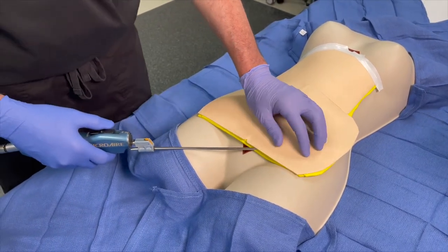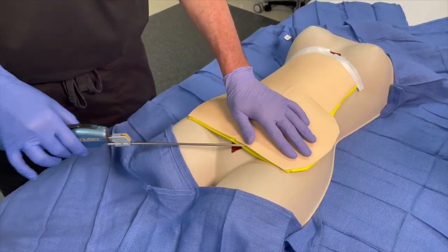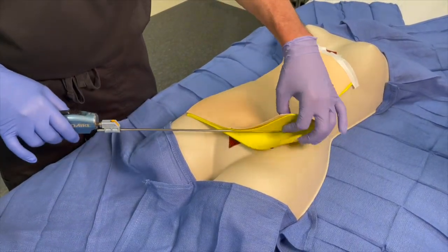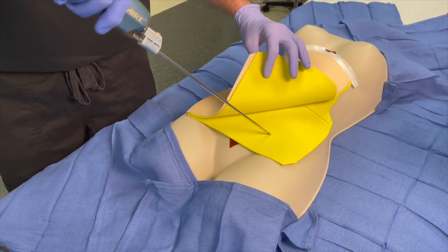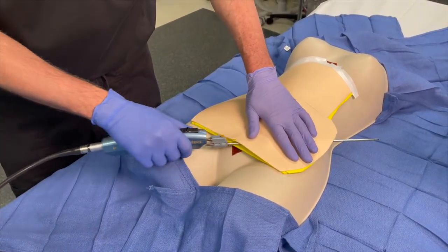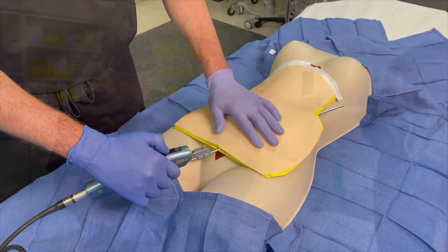The important thing is I always know where the tip is, and that's very important. You can think of it like playing a violin or a cello — the bow is just gliding across the surface of the abdomen, never angled inward, so you're never actually stabbing anyone with liposuction. It's just gliding back and forth, always knowing where that tip is, and that's how we do liposuction safely.